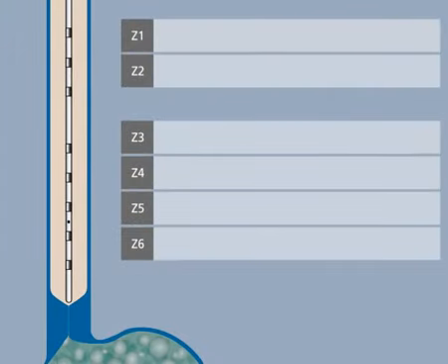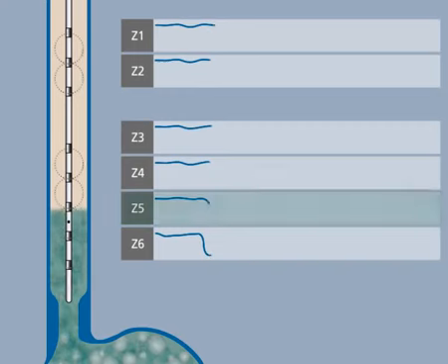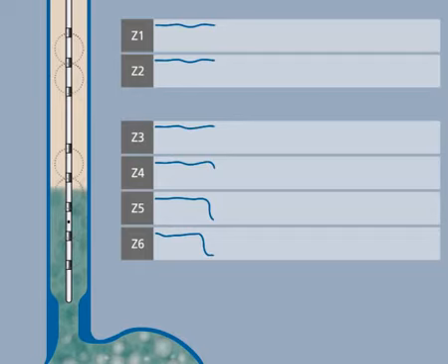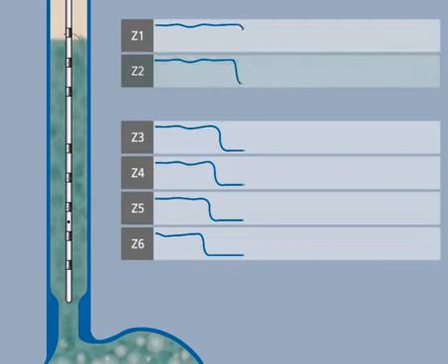Reflux means that gastric contents move up into the esophagus. As soon as it reaches channel 6, the impedance drops. As the refluxed bolus of gastric contents is moving farther up, channel 5 is reached, and the impedance level of that channel also drops. This continues until the reflux bolus reaches its highest proximal extent.